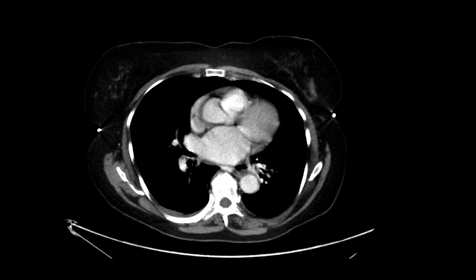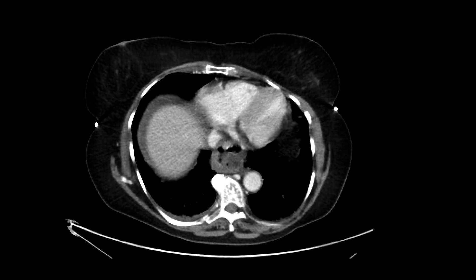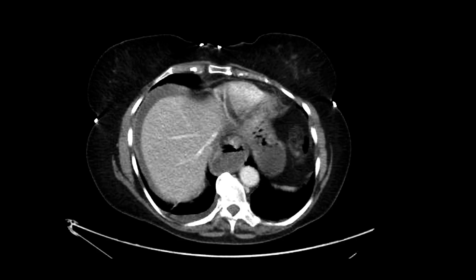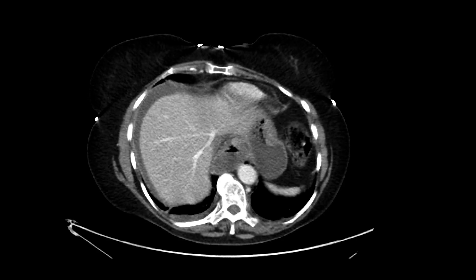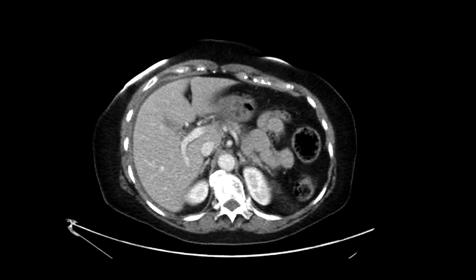This is a patient who comes in with right lower quadrant pain and gets a CT scan with intravenous contrast. We can immediately see that there is some right upper quadrant free fluid in the right subdiaphragmatic region. There's also a small to moderate size hiatal hernia.